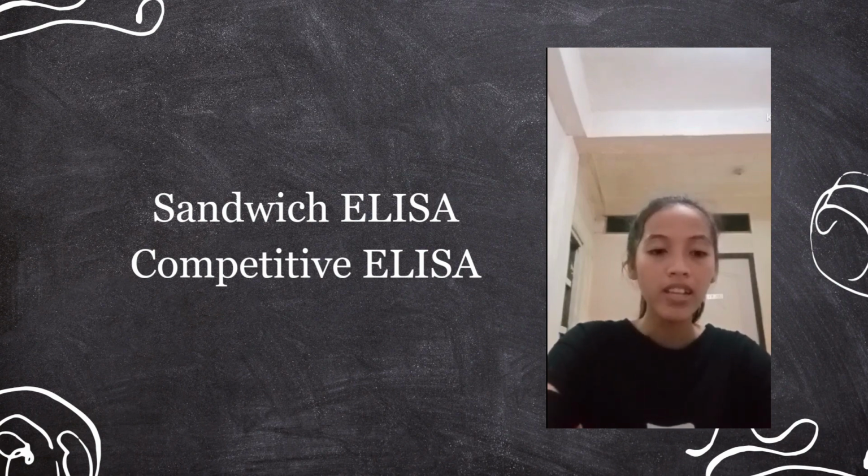And competitive ELISA is commonly used in research and diagnostic laboratories for the detection and quantification of various proteins, molecules, hormones, drugs, and environmental contaminants, and offers high sensitivity and specificity and can be used to measure a wide range of target analytes.